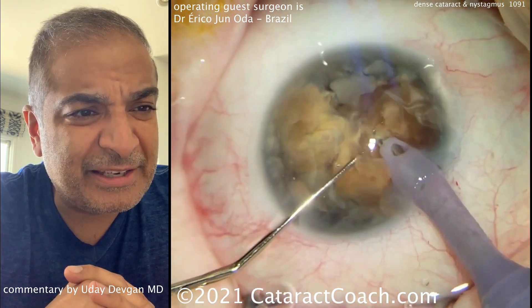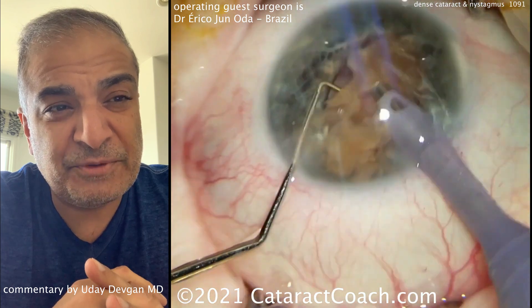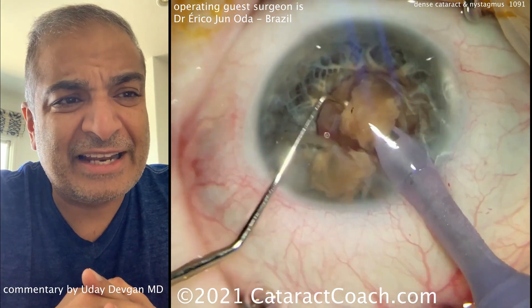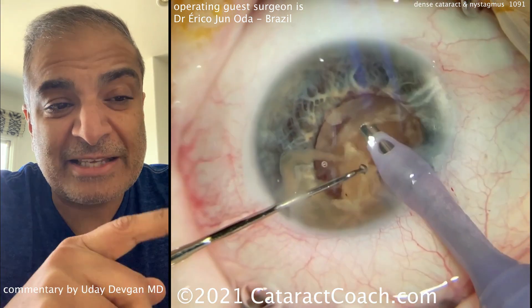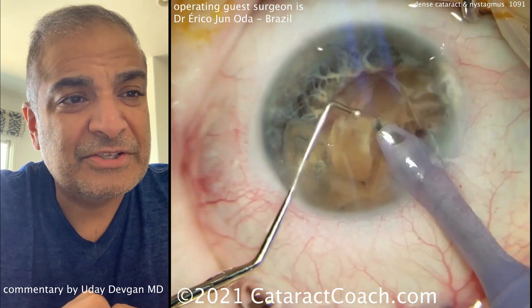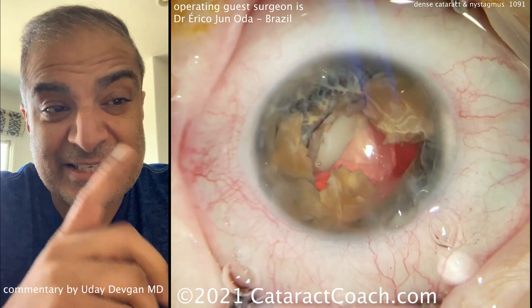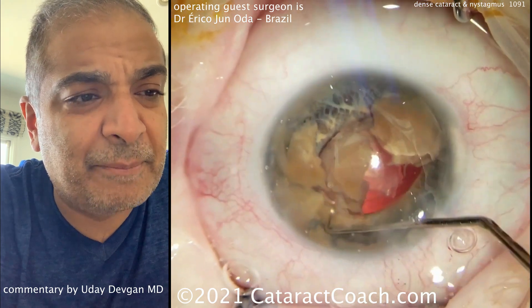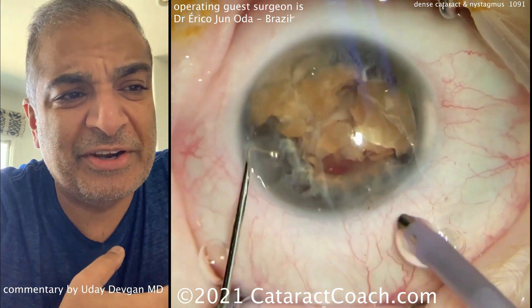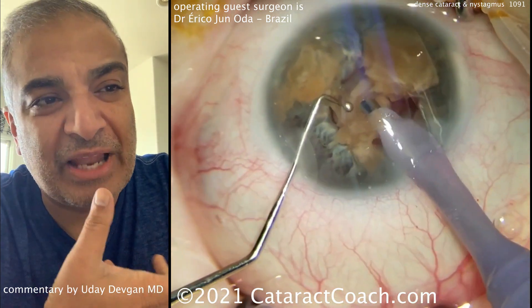Let's see what's happening now — moving the pieces around. Being a little bit in the anterior chamber is okay for a case like this. Use more dispersive agents if you want. Notice how he's got that beveled down position — I think that works really nicely. He's really trying to work at that iris plane. And despite being such a dense cataract, you're going to be surprised — there's a post-op video at the end where you'll see the cornea is clear on post-op day one, and even better on post-op day seven. Here are the last bits of the pieces. Even if there is some corneal edema, it'll resolve. Using that chopper to push the pieces centrally into the deeper part of the anterior chamber makes it much easier to use the phaco probe. Remember, this iris that's lacking pigment also has a little more laxity and floppiness — you've got to be careful with that.